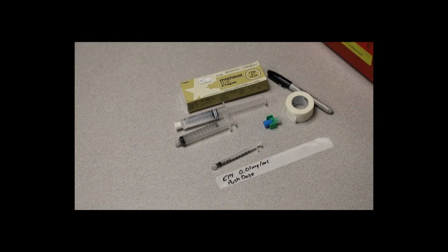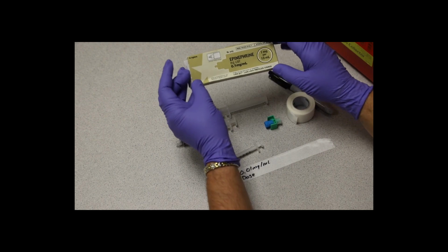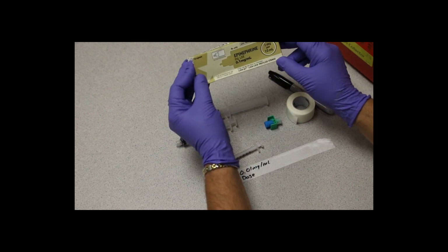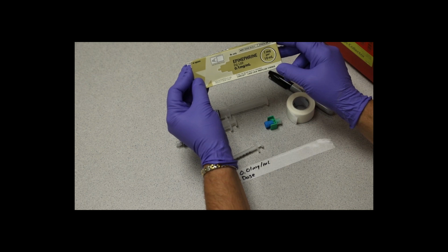Reviewing my patient rights. This is for my patient. The medication I need is epi, so this is correct. The dose I need is 0.1 milligram or 1 ml of this solution. I need to dilute it before I administer it via IV. I'm giving it for hypotension.